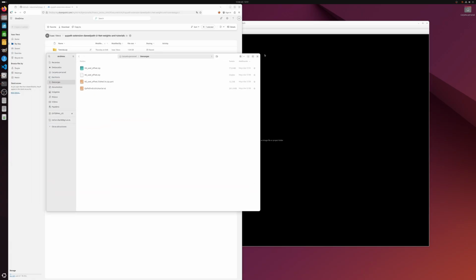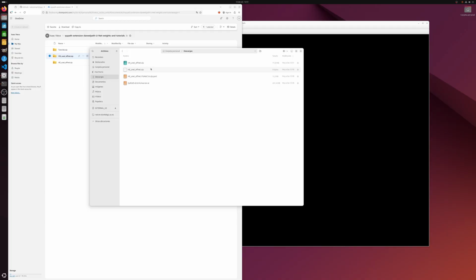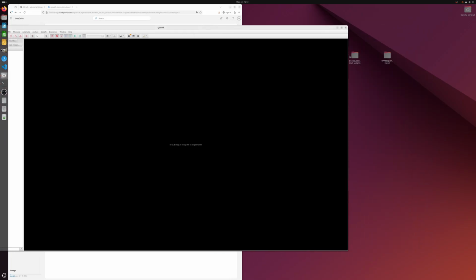Let's see if, okay. So I'm going to extract this one, and I'm going to extract this one over here. My recommendation is to copy the folders and place them on your desktop or wherever you want, right?